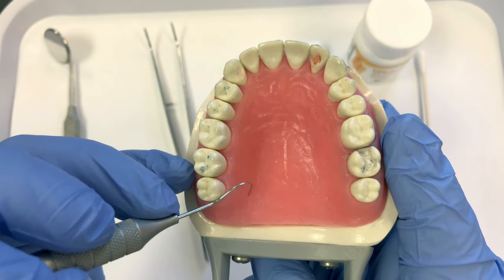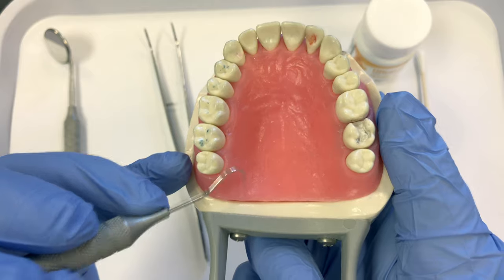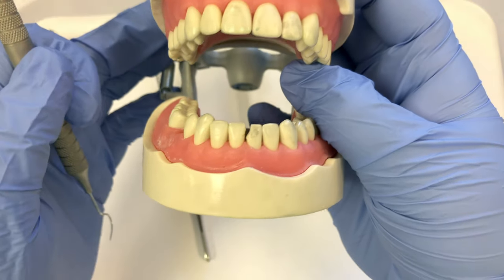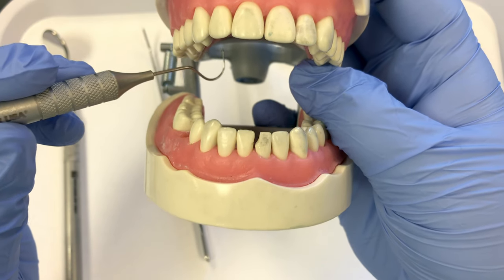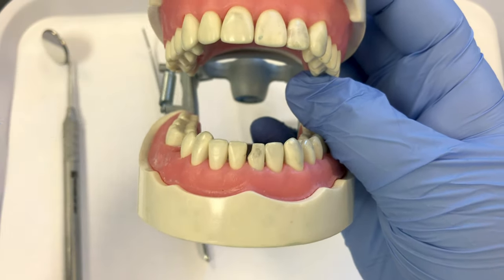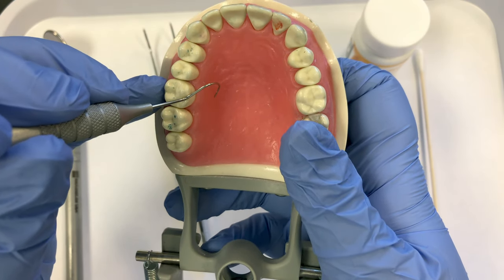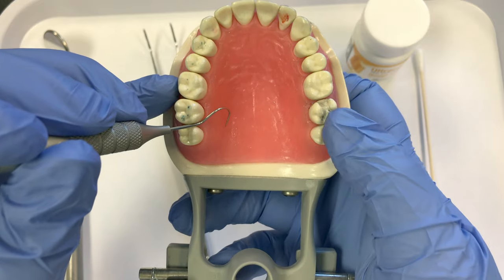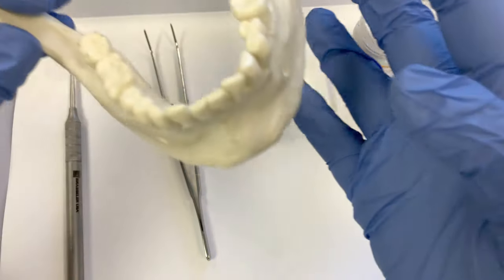For the greater palatine block, the greater palatine foramen is located back here, but the patient probably won't be able to open more than this, so the doctor cannot inject straight up near that foramen. The doctor has to inject at an angle, inserting palatal to the first molar, and the needle will travel back under the soft tissue closer to that foramen.